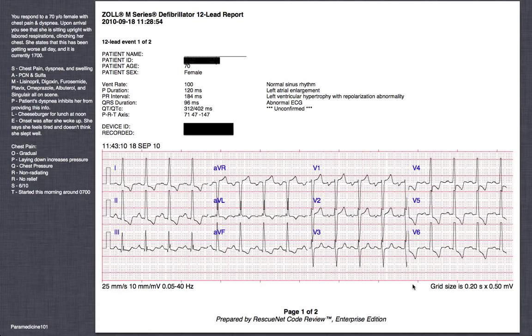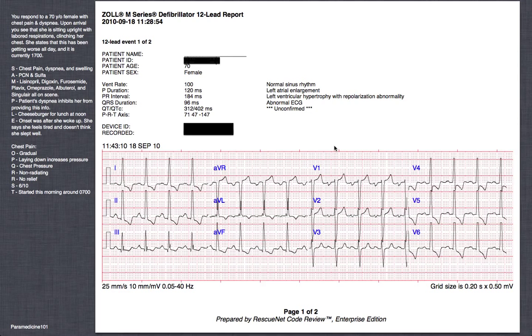Looking at it from afar — I always do that bird's eye view of the 12-lead EKG — you certainly see some abnormalities. Looking at the Facebook comments, a few people thought inferior wall MI, a few thought anterior wall MI, and I can see why. AVL looks like it would with an inferior wall MI, and there's some ST elevation visible. I can tell you it's neither. Many commenters picked up on left ventricular hypertrophy with a strain pattern. The GE Marquette interpretive algorithm from Zoll indicates LVH with repolarization abnormality — that's essentially the same as LVH with strain.